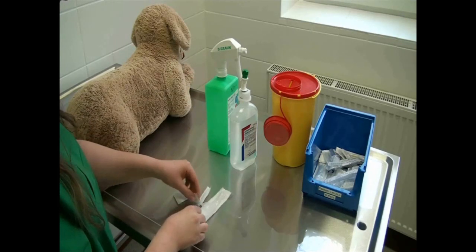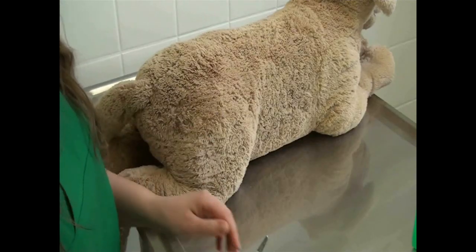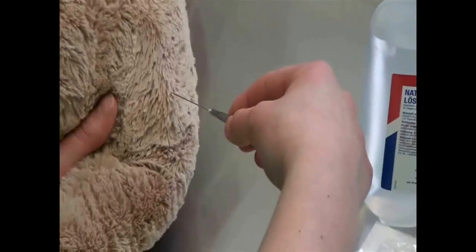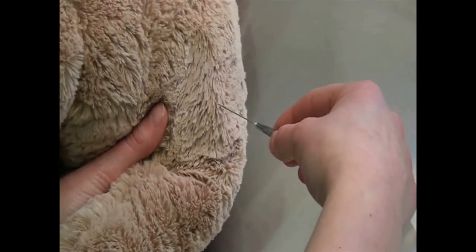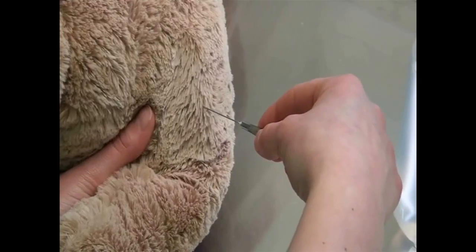The injection site is between the ischial tuberosity and the stifle. With your free hand, isolate and hold the muscles or the whole leg of the animal.